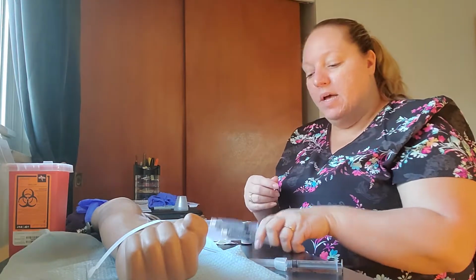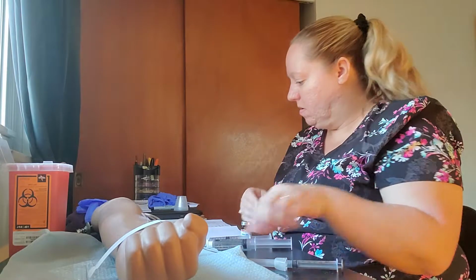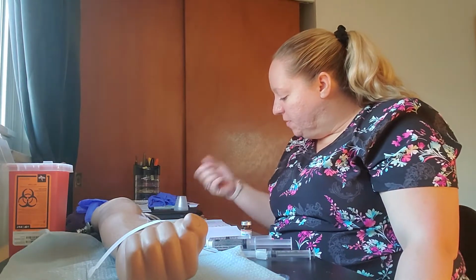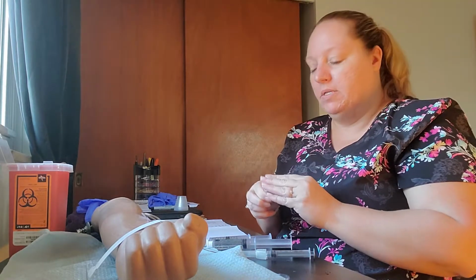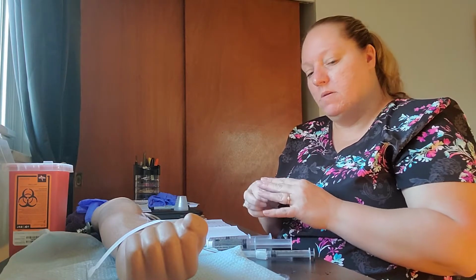I have my syringes with normal saline in it. We're going to give 3 milliliters before and after. I do have my syringe here ready to go with my 22 gauge needle. I checked the allergies for penicillin. We're going to clean the vial. Some institutions say 60 seconds, it just depends on your policy at your place of work, your employment.